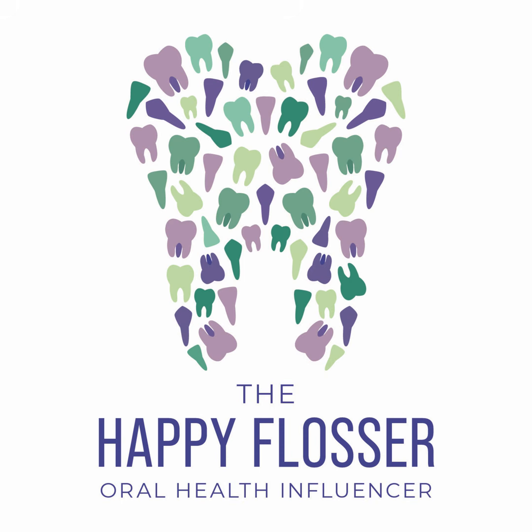When you have a lesion that's ill-defined, it has a wide zone of transition, it's kind of blending, or it's aggressive. It wasn't there on the last radiographs, and now it's really quite substantial in size. It's non-corticated and irregular. Those are a little more serious. So if you note something, you want to look at that architecture and you want to look to see what those borders tell you. And that's really important.